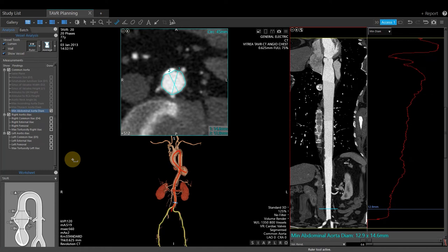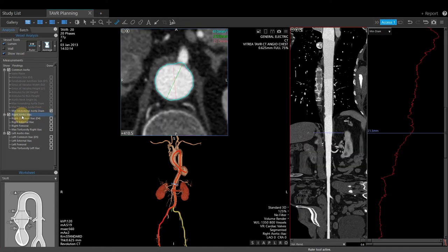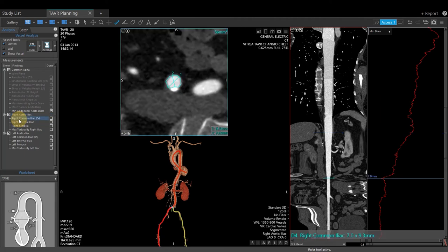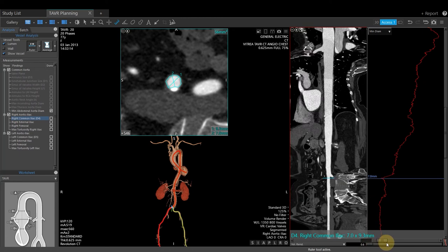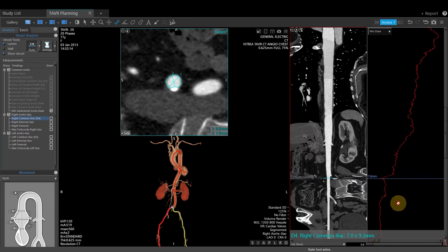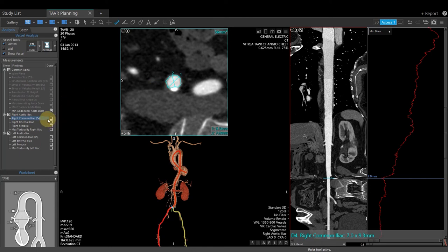We will now create measurements on the right aortic iliac. Left-click the right aortic iliac to pull up that vessel. The first measurement will be the right common iliac — left-click to select. In the straightened vessel view, rotate and visualize the vessel. Note the histogram aids in creating this measurement. If happy with where the measurement is, click Done and lock it in. If not, drag the slide bar to navigate to the proper area, evaluating the contour and the max and min in the short axis view. Once satisfied, click Done, then snapshot to save.